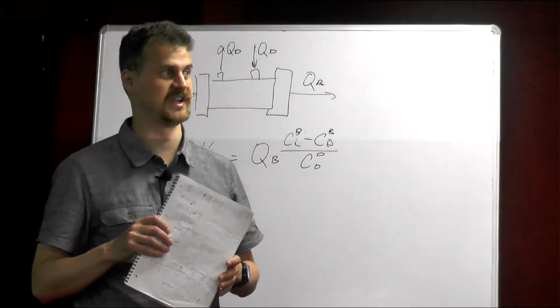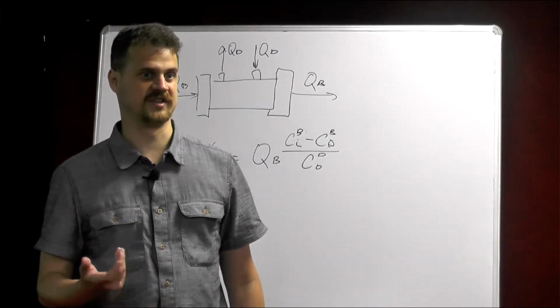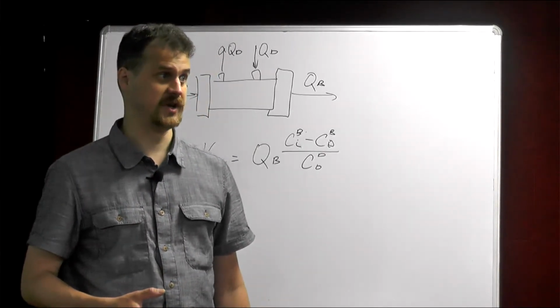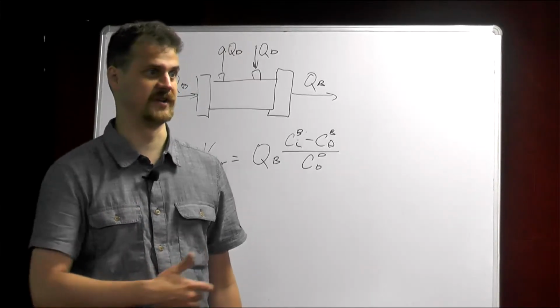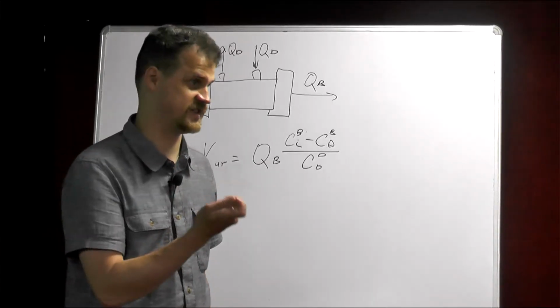So it's one of the technical issues that have to be resolved for the implantable artificial kidney. We need to miniaturize this apparatus in order to implant the device into the human body, making sure there is no discomfort and no severe interaction between the apparatus and the internal organs. We need to miniaturize the sensor itself.